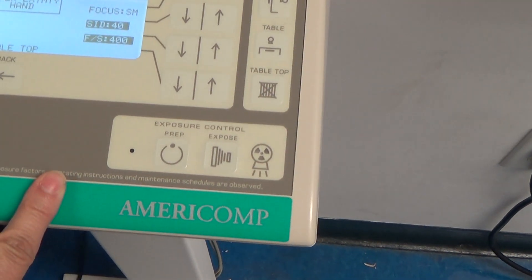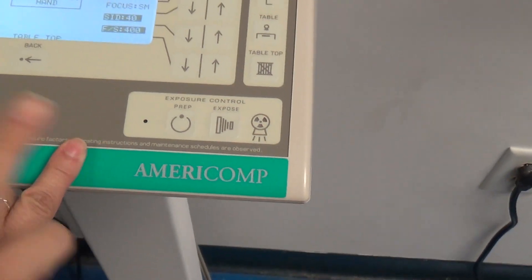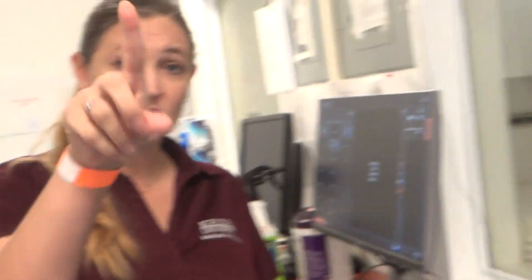We want to make sure we don't have anybody in that x-ray room before we hit this button. The other thing, especially on this side of the room — the door needs to be closed because you don't want someone accidentally walking in while you're taking an exposure.